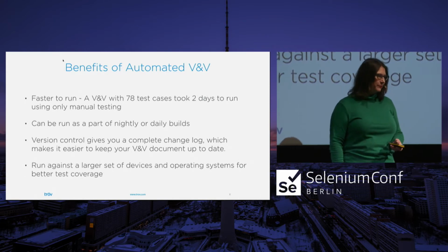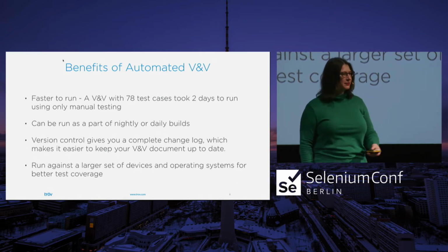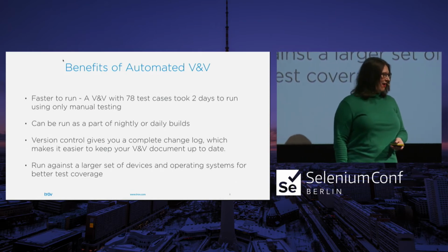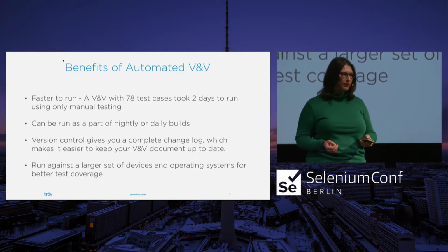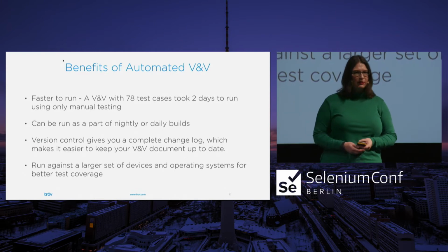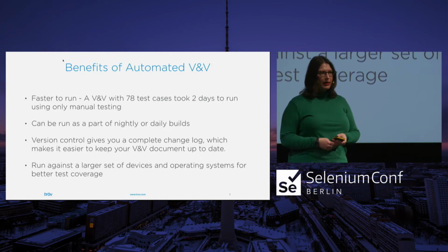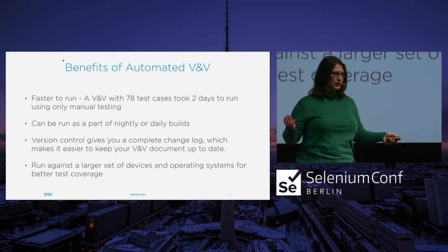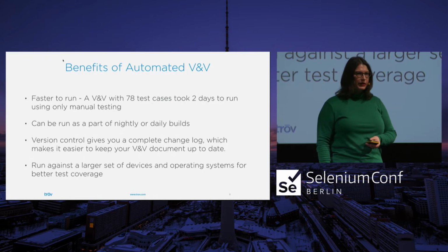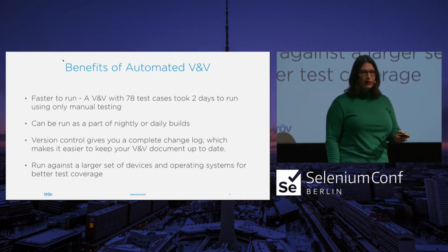So we ran them as a part of our process constantly, several times a day. We actually grabbed a laptop and said, this laptop just runs tests. That's all it does. You can also, depending on how you have things set up, make use of something like a device farm. For us, we couldn't, because we needed to interface with the IOP medical device. But if you can make use of a device farm, you can test on a wide range of operating systems and on a wide range of devices, which gives you really good coverage and a good idea of if your software is working as you expect.